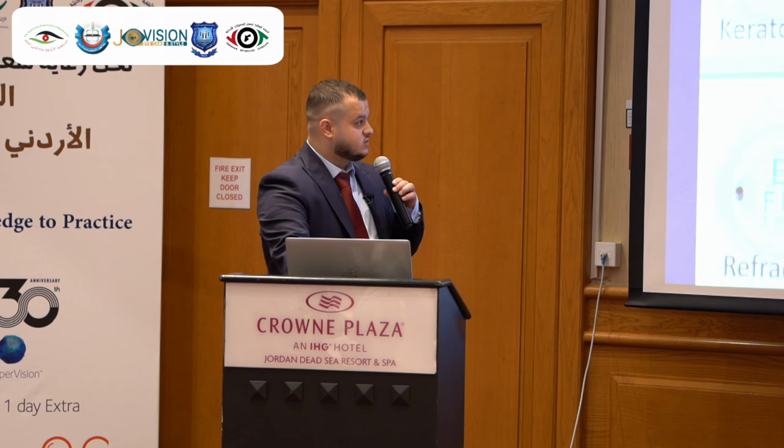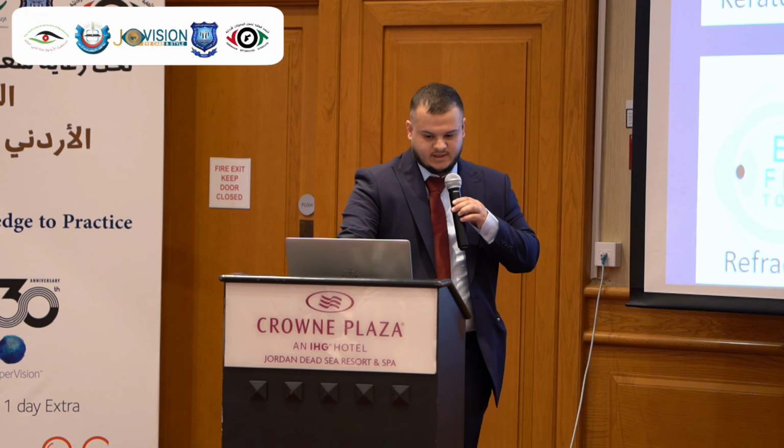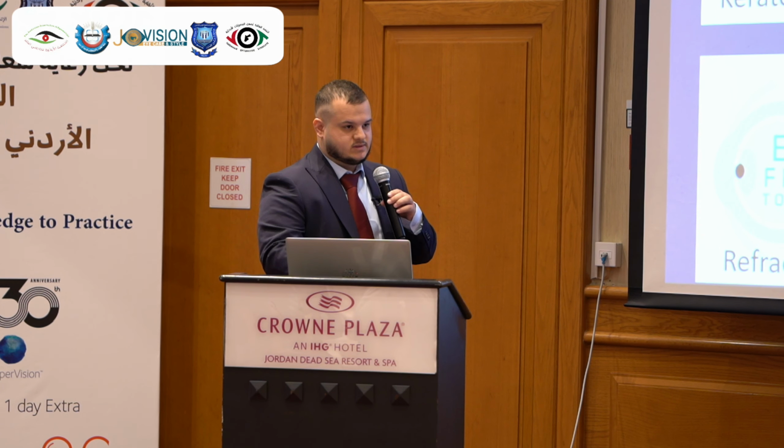We do a pre-fitting evaluation through corneal topography and ocular health assessment to ensure suitability and establish a baseline. This is the device we use to measure the axial length, the Myopia Master from Oculus. This device also measures keratometry and refraction. We use a Snellen chart to measure the visual acuity. In every Ortho-K case, we should have a baseline to compare before and after, and to make sure that Ortho-K has worked well.